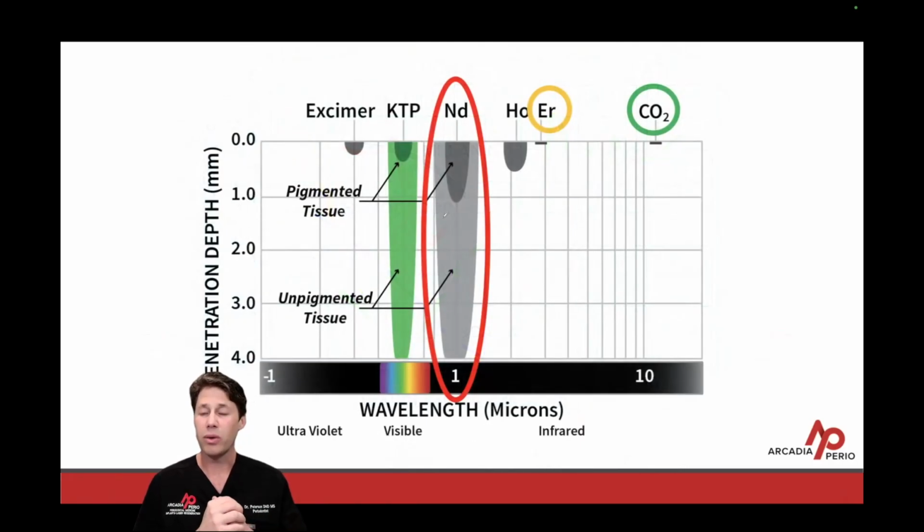So now let's talk about, not only have we talked about the wavelength of light, where it's selectively absorbed, but now I want to talk about the depth of penetration, right? The Nd:YAG laser penetrates well beyond the laser tip. It's going to penetrate 4 to 5 millimeters beyond the laser tip. And remember too, the light is divergent when it comes out of the laser tip at 13 degrees off center. So a divergence in total of 26 degrees.